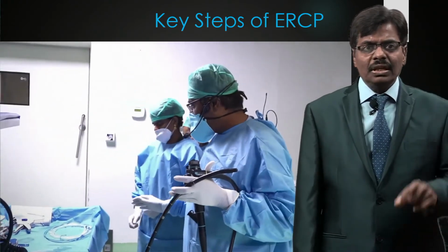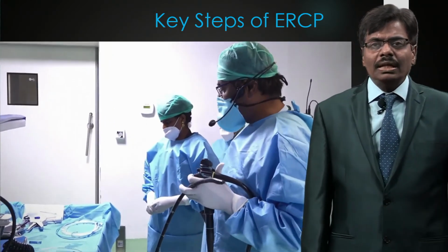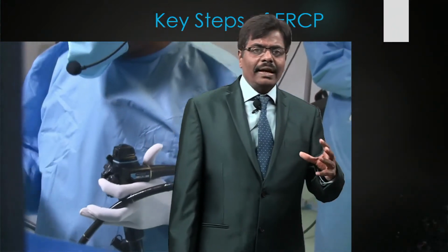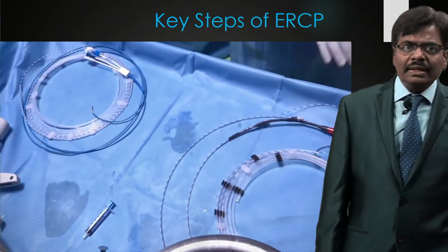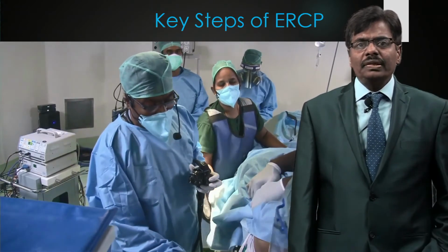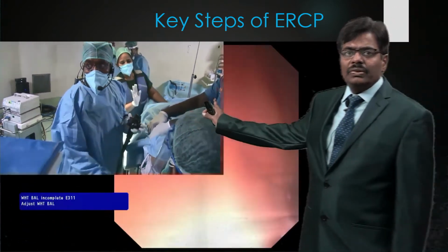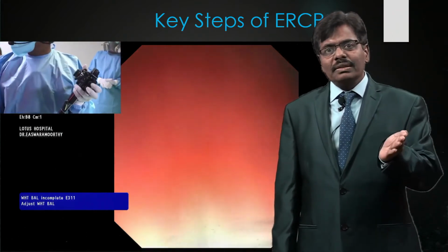Say I have 2 staff nurses, especially when we are using a complex procedure, and we have a nicely laid out table as I just showed in the previous one, and see how I am comfortably holding this with a single hand while I am trying to advise the anesthetist to give the injection. And then here is all the layout, as we rightly said, the sphincterotome, balloon. You can see even a glimpse of the Alliance gun, and the patient is there. My person here is actually lifting the patient's shoulder. So the patient, even though he is prone, is brought semi-prone.